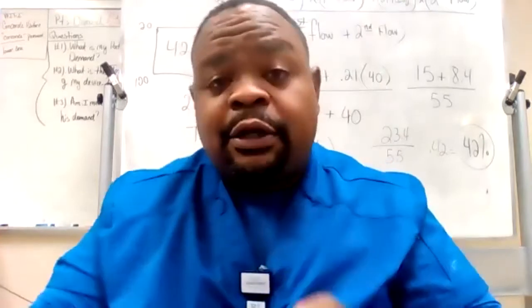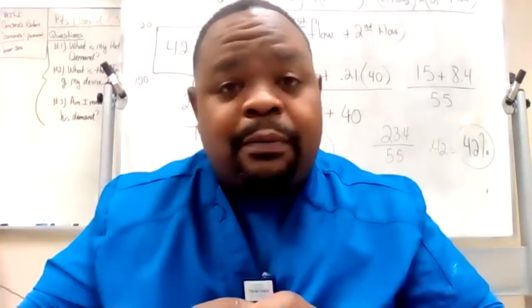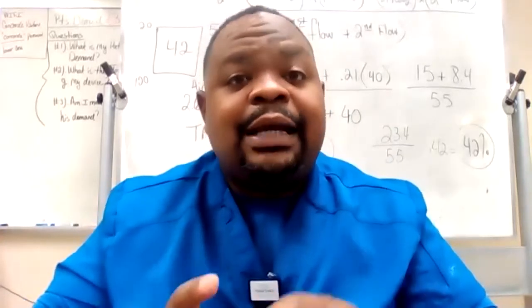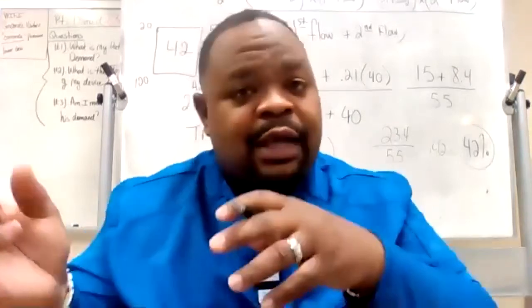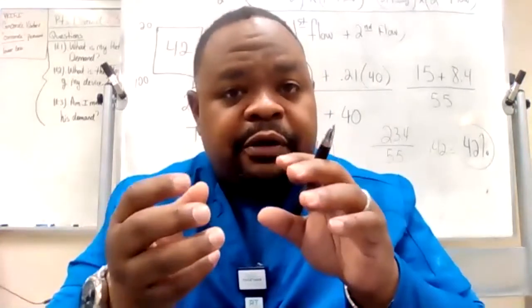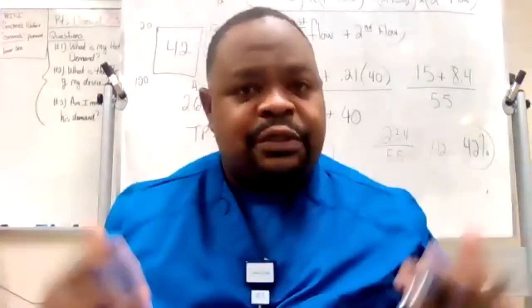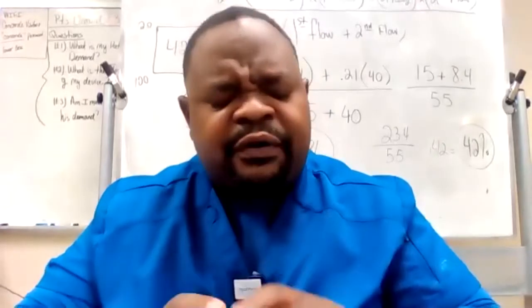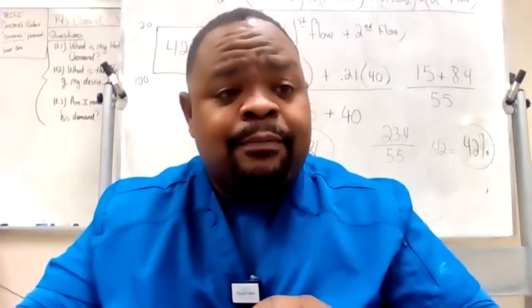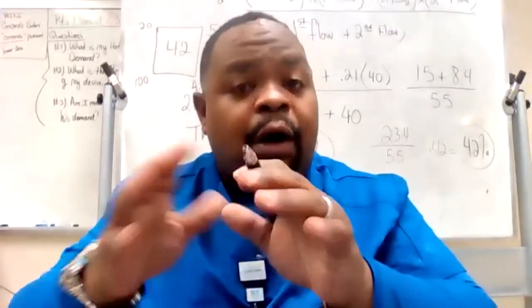Now, you're about to learn how intricate these analyzers are, and you don't have to remember how intricate they are. Some of them have a diaphragm, and when the oxygen goes in, it makes a little mirror move. The mirror reflects off another mirror, and that tells you the percent. You don't have to remember all that. They are very complicated and sophisticated, and it's good to know, but you won't have to remember all of that.